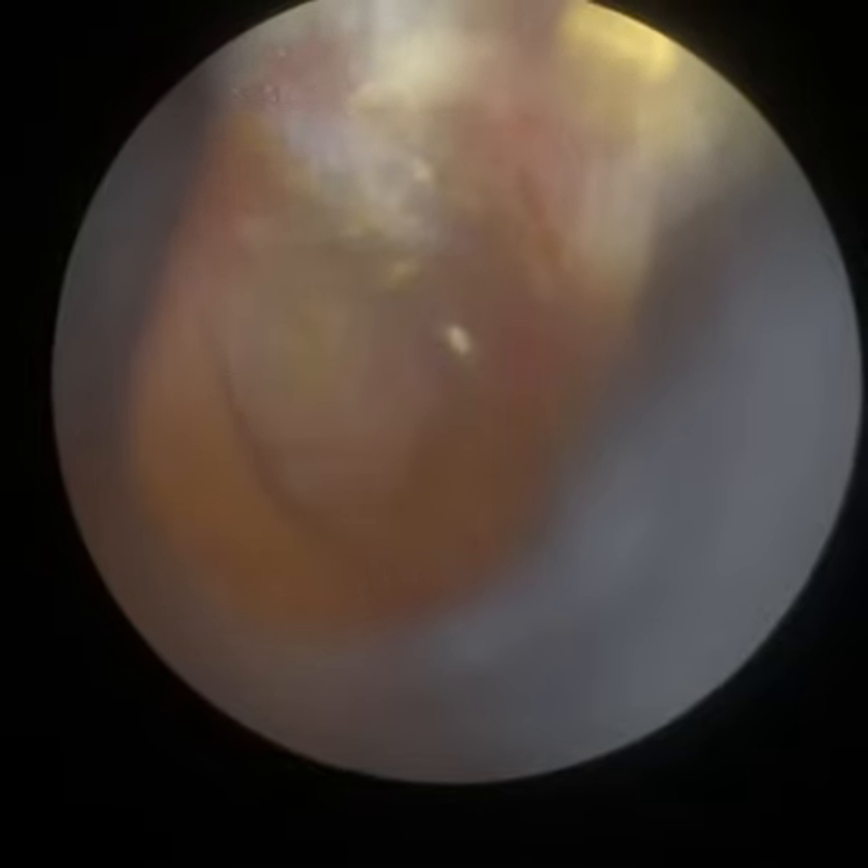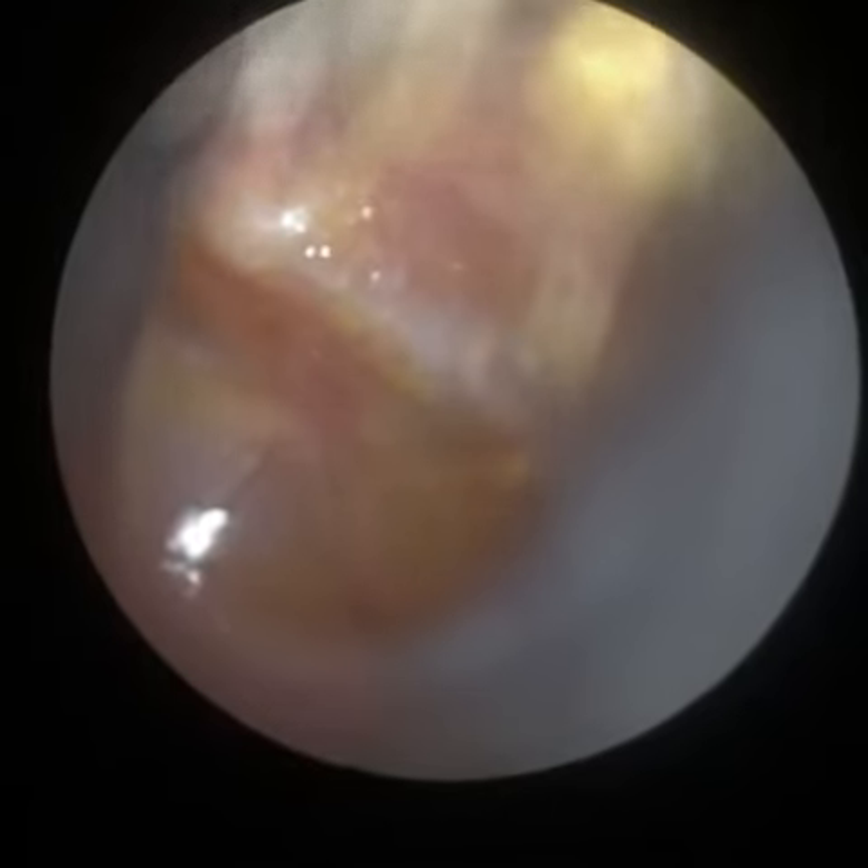You can see the blood vessels have just become more visible, so possibly a slight tympanic retraction there.